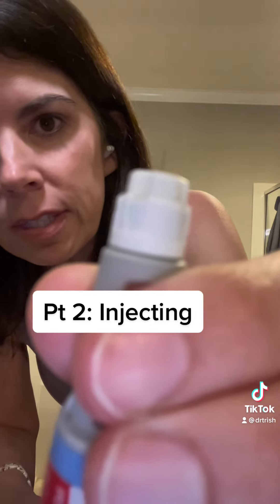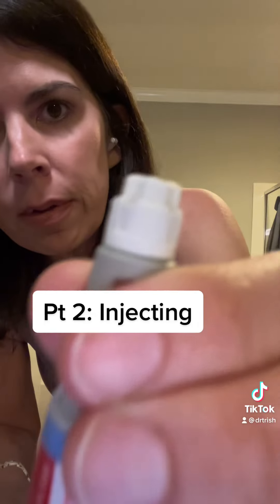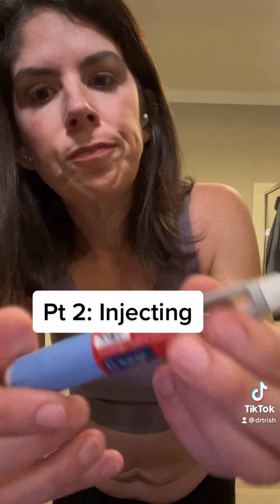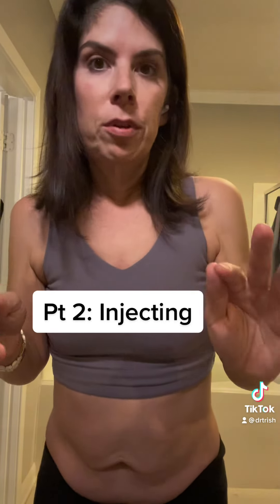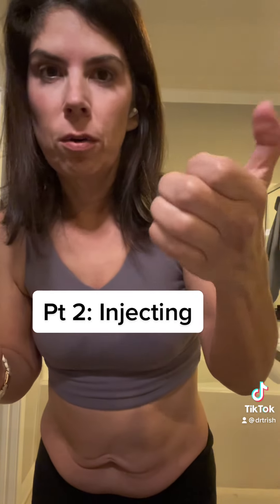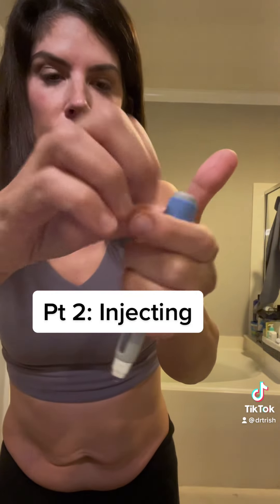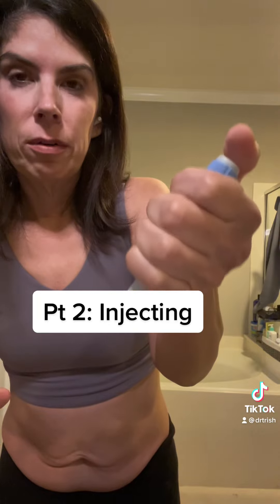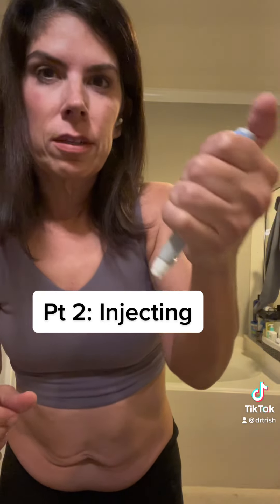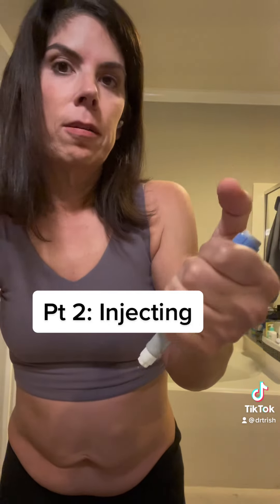When you dial it up you can usually see a little drop of medicine go to the tip — so it's primed and ready. With all these pens, you're going to hold it ideally with your dominant hand, gripping it with your fingers. Then you push down, because you do have to use a fair amount of force to push in the button on any of these pens.